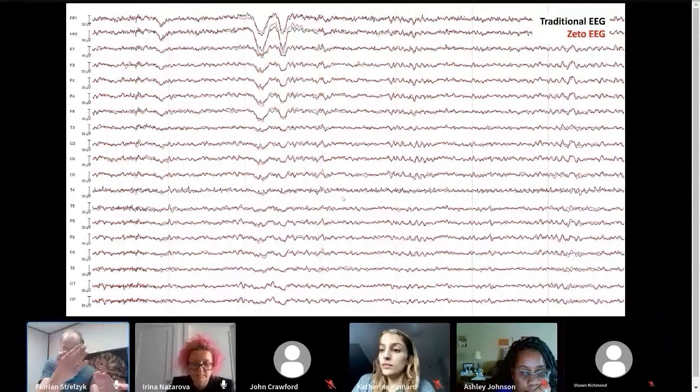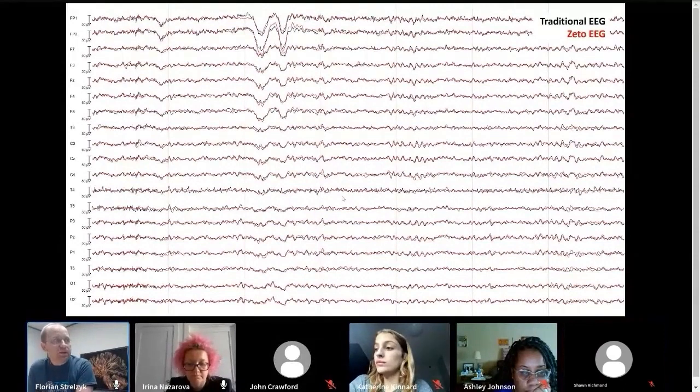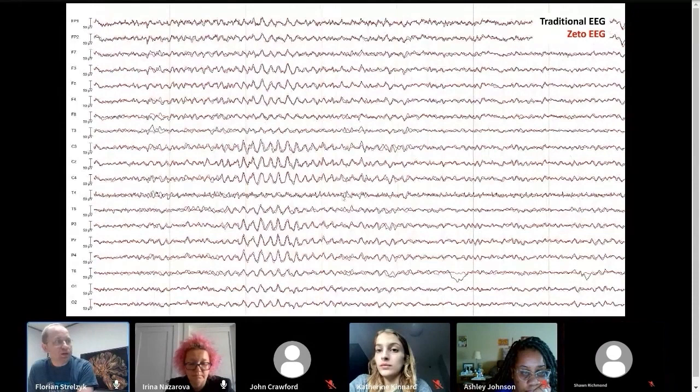And if you change your location, you change your amplitude and some attributes. But if you wouldn't know that one is dry, the other is gel-based, there's no way to tell this apart. This is another way of looking at it. Now, I'm looking here at a referential montage that's not bipolar. That's simply for these types of comparisons, it's a little bit cleaner to have a referential montage.